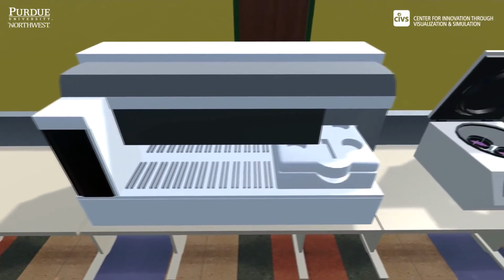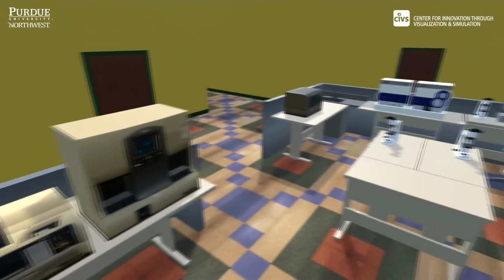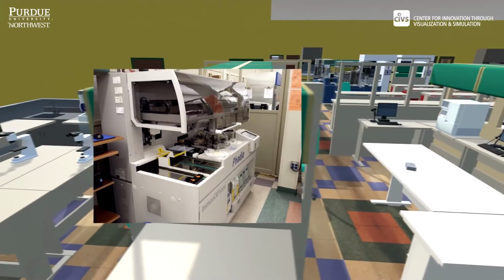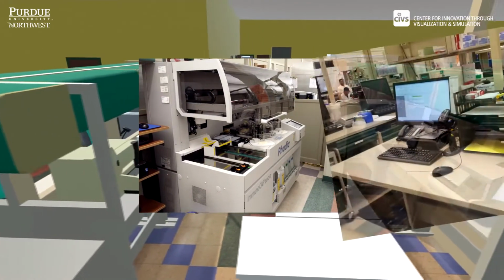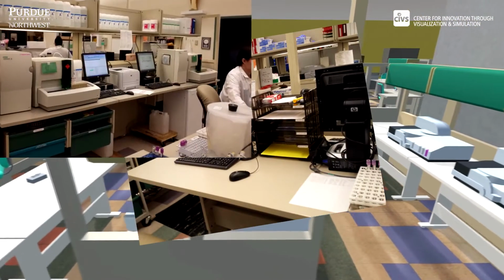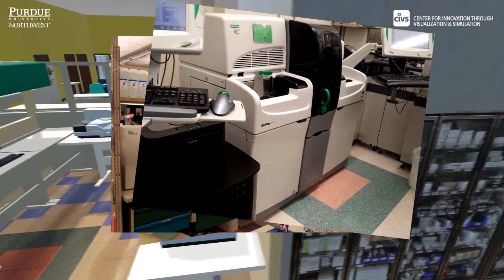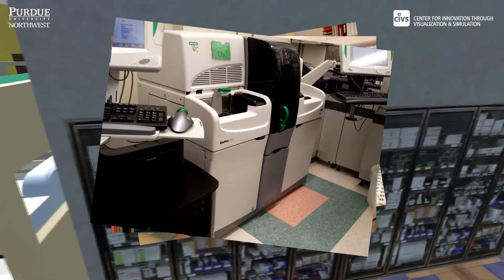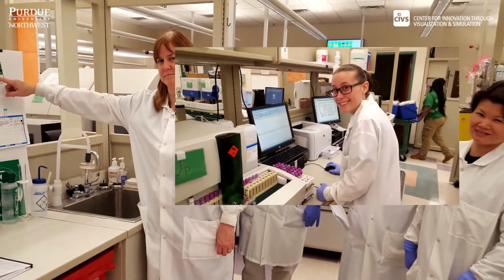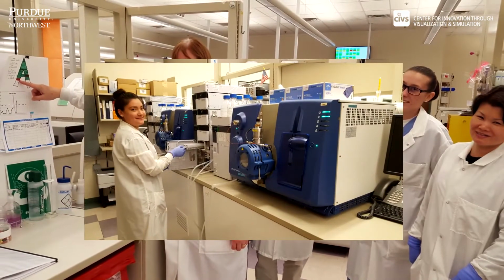Other methods of testing in the general lab department provide results as varied as counting and identifying the cells in blood and body fluids, to determining what your child might be allergic to, to the risk that an unborn child may have certain birth defects. Physicians diagnose diseases as varied as diabetes and leukemia, infertility and vitamin deficiencies, gluten sensitivity and cancers via diagnostic testing. The general laboratory is truly a remarkable place, and it requires a team effort of dedicated individuals to help provide excellent care for our patients.